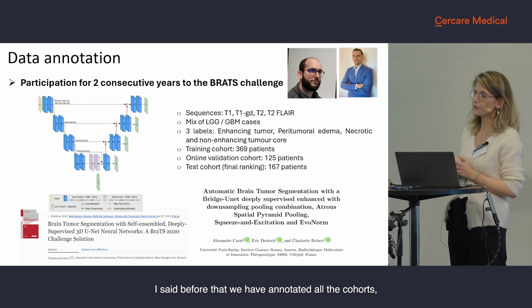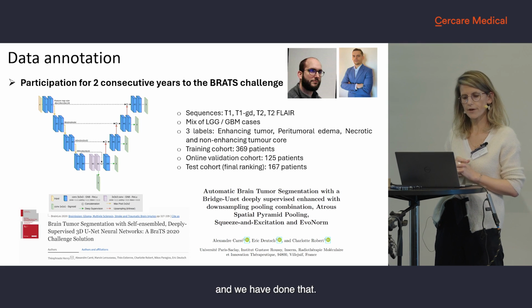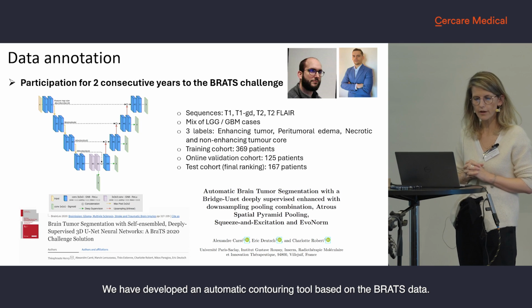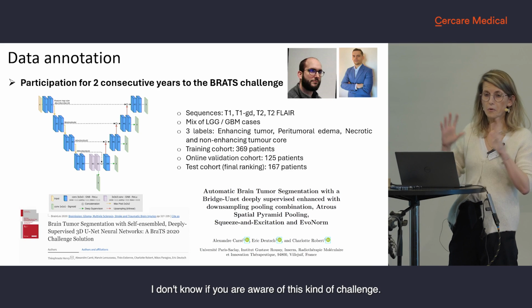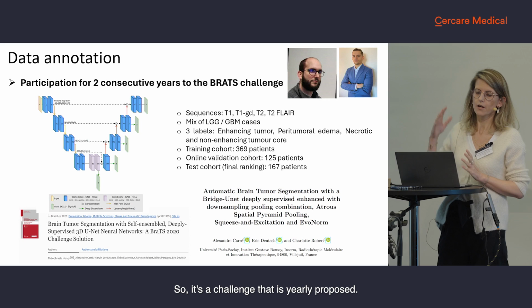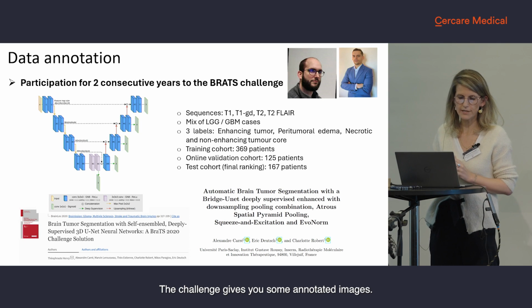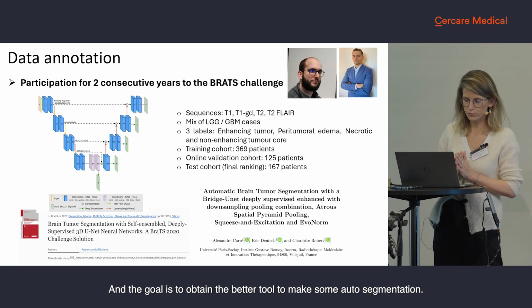And I said before that we had annotated the whole cohort. How have we done that? We have developed an automatic contouring tool based on the BRATS data. I don't know if you are aware of this kind of challenge. It's a challenge that is proposed yearly, and the challenge gives you some annotated images, and the goal is to obtain the best tool to do auto-segmentation.